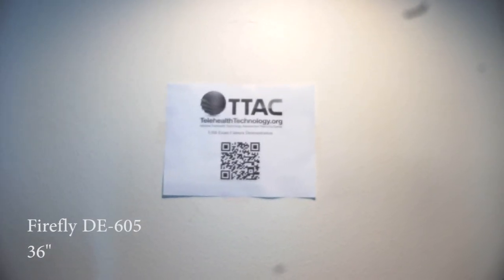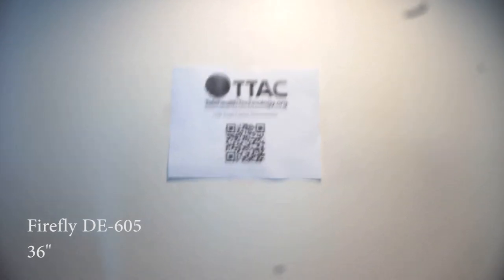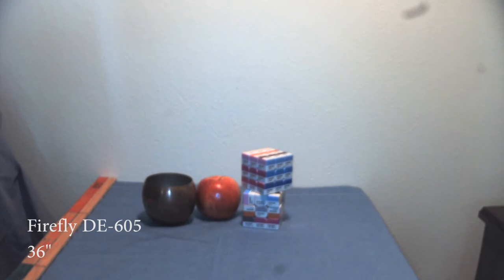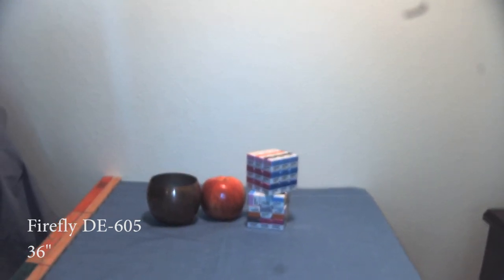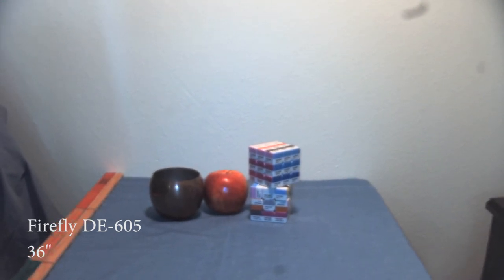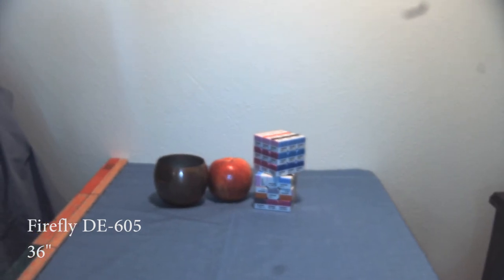In this demonstration, we will show the ability of the Firefly DE605 to capture images of test objects at a distance of about 36 inches or 3 feet from the camera lens. Note how the manual focus needs to be adjusted for objects to be seen clearly. Images taken from this distance are useful for visualizing the anatomic location of complaints and for assessing movement.